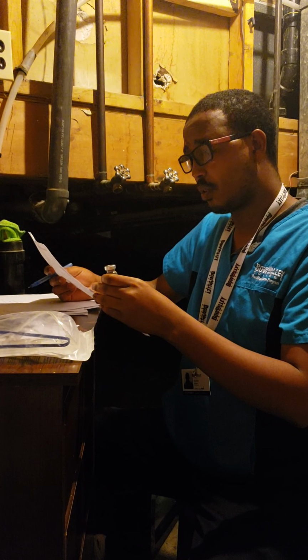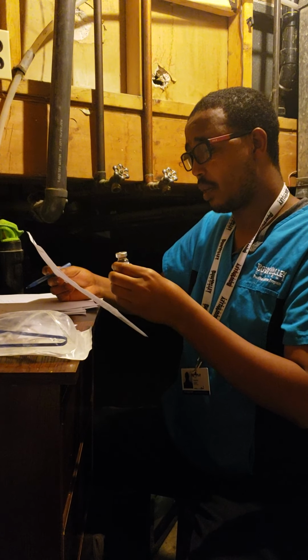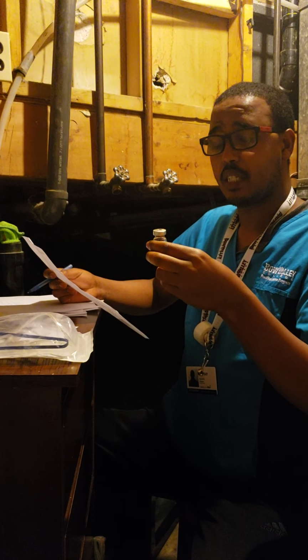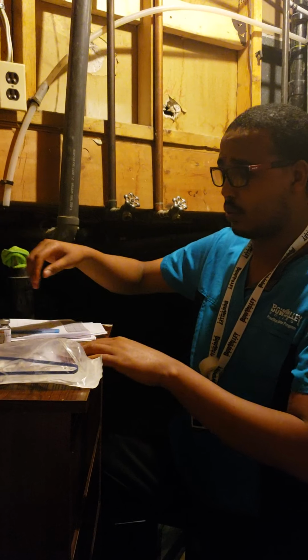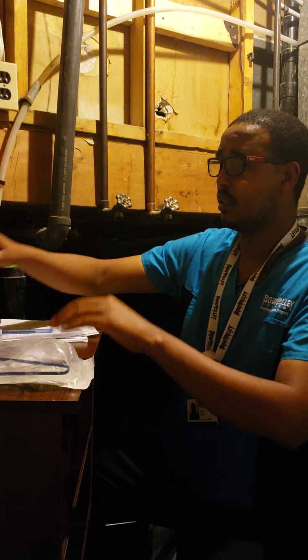From the MAR, I have dexamethasone 8 milligram IV piggyback, 1 time prior to chemotherapy. I'm going to use this medication for anti-emesis. Okay, I have done first check. So the next one is I have to withdraw my medication. To do that, I'm going to clean it.